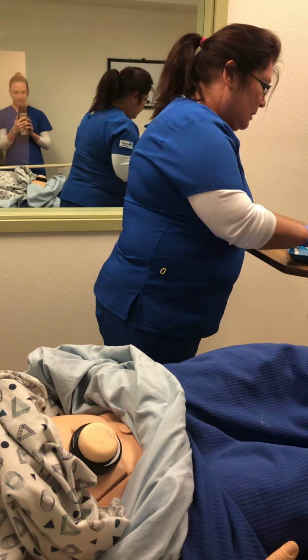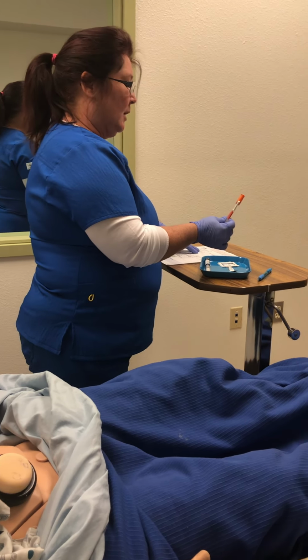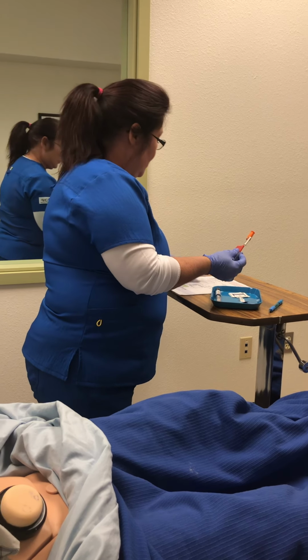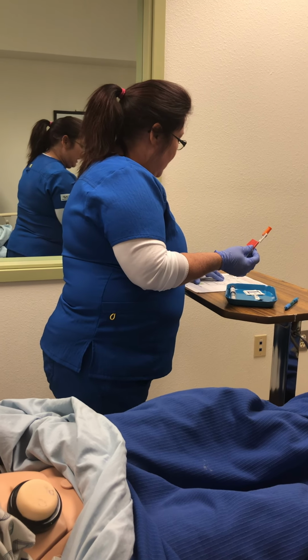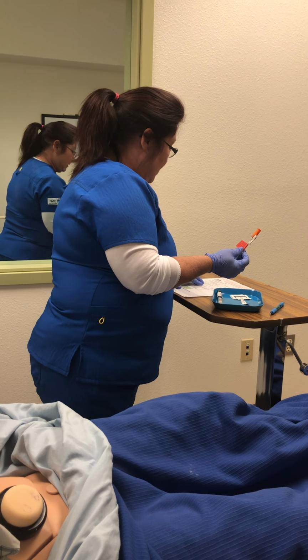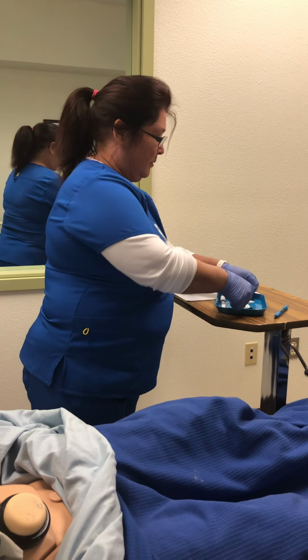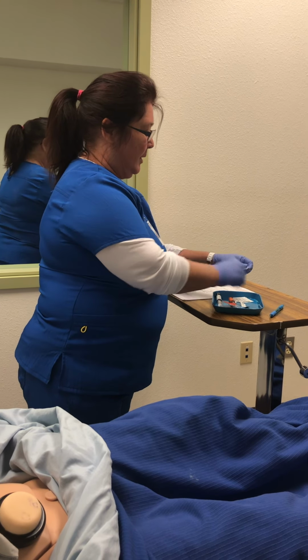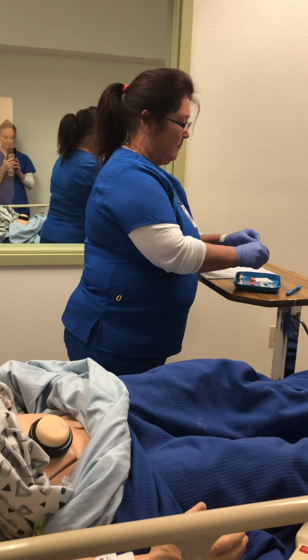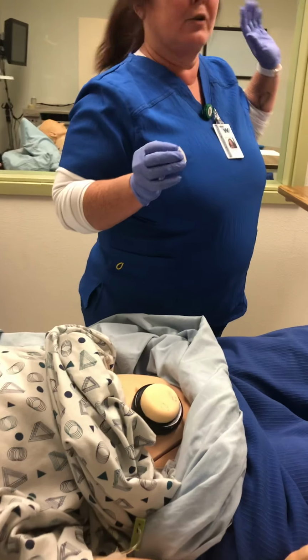And I've got in the syringe my regular and my NPH. My regular has 10 units. My NPH is 15 units, which matches my MAR. The NPH 15 units, and the 10 units subcutaneous on the regular insulin. So I'm now going to get an alcohol pad, and I'm going to clean the site. And I have drawn a curtain for privacy.